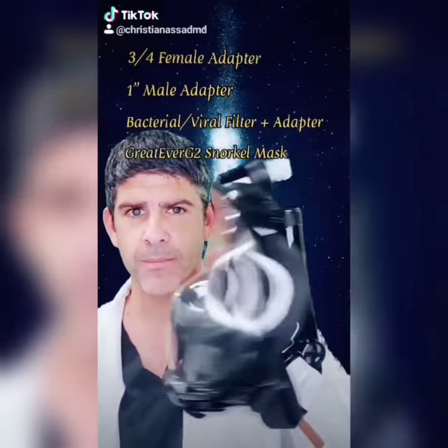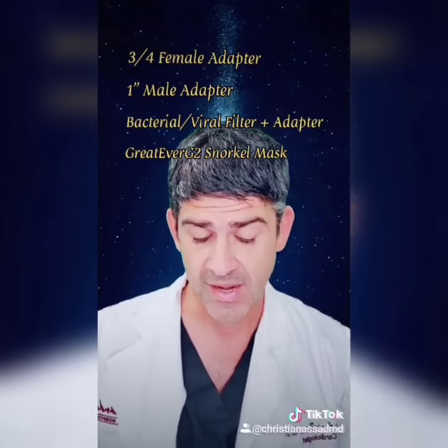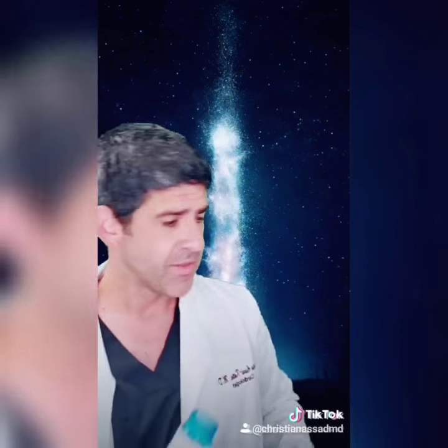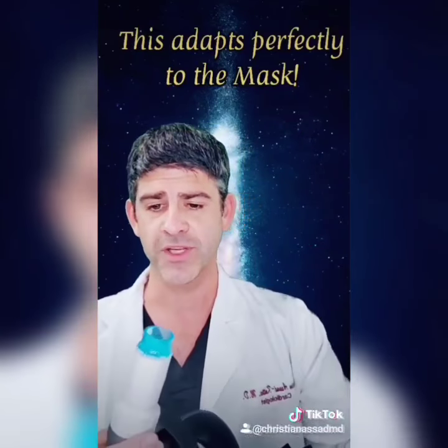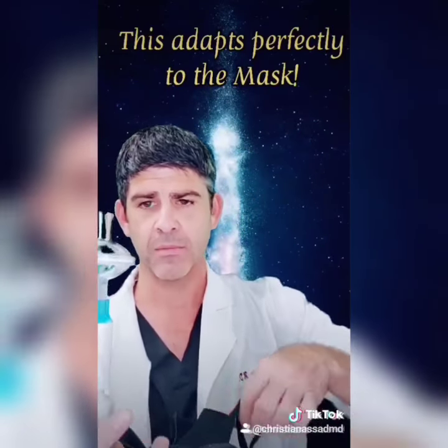We've got this GreatEver G2 snorkel mask, which we're going to be using, and it works fantastic. Initially I thought the adapter wouldn't fit, but this is what you come up with after you assemble it — you use the epoxy glue and everything, and you just put that thing there.